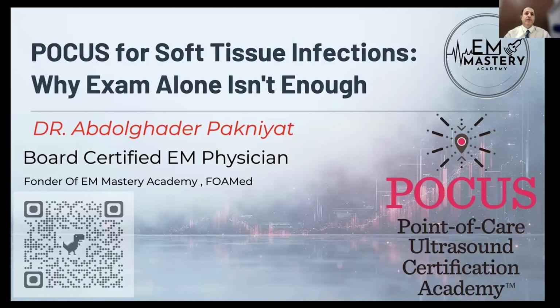Today we're not going to talk about applying point-of-care ultrasound in critical care, in sepsis, in shock, or in CPR. We're going to talk about POCUS in something that maybe seems not critical, but if you miss it, it ends up with critical sepsis and a bad outcome for the patients.